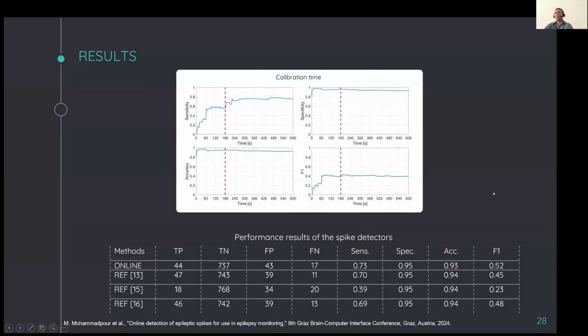The F score compares the model output, trying to balance between the 2 groups. The reason it is low is that the number of non-spikes is much higher than the spikes. In the literature, usually when we want to compare two algorithms, we count the number of detected events.